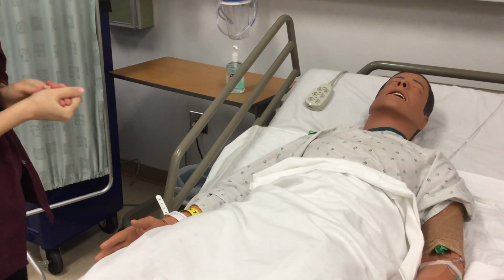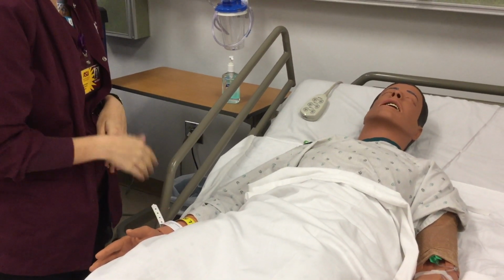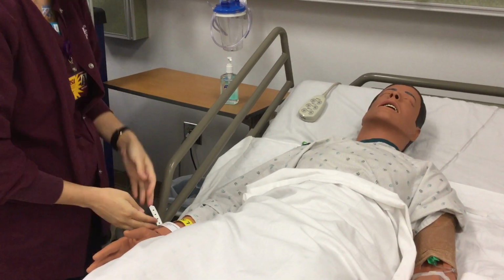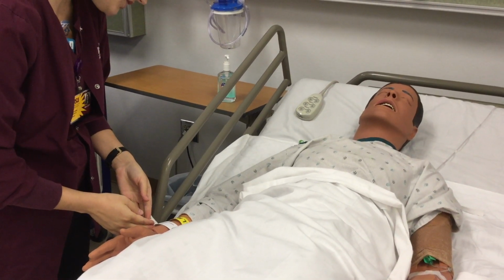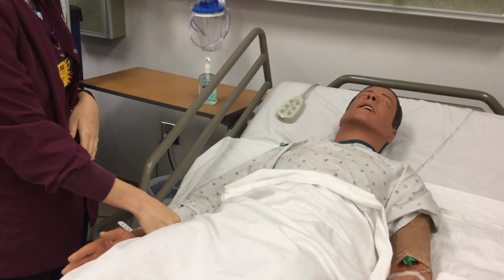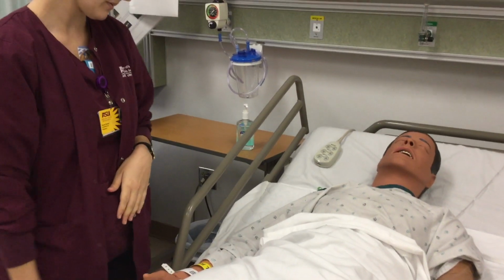Before we get started here, can I have you state your first and last name and your date of birth, please? Chesty Chester, May 15th, 1989. All right, perfect. Thank you. And do you have any allergies? No. All right, awesome. And I do see that the patient has a fall wristband.